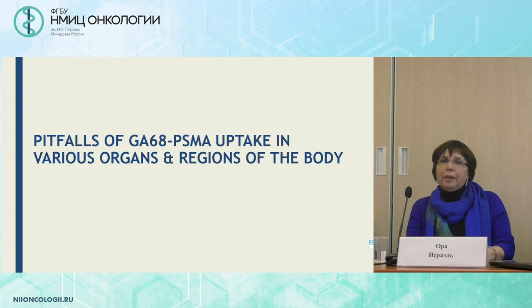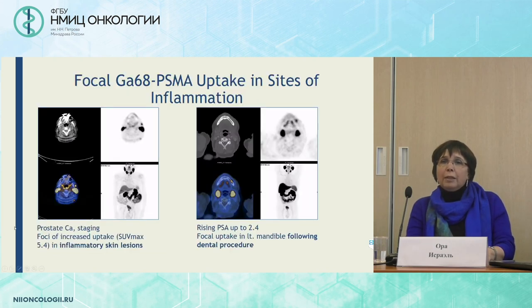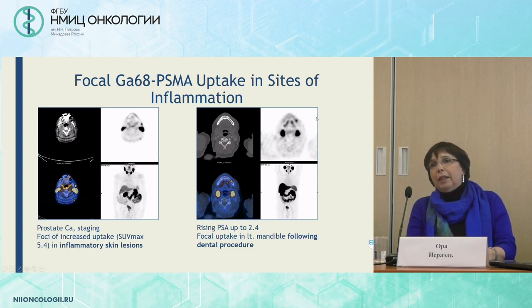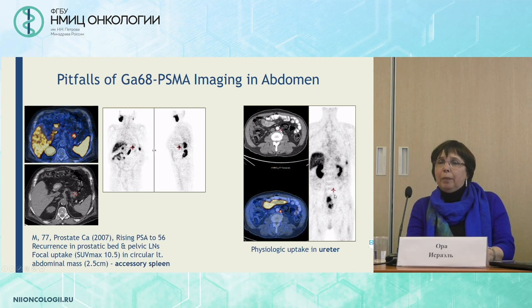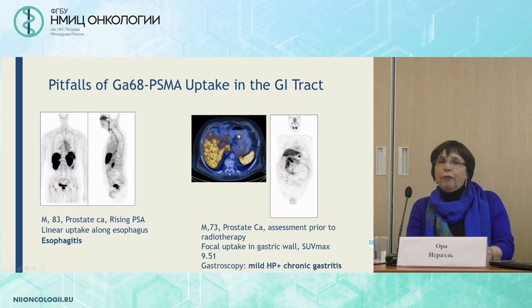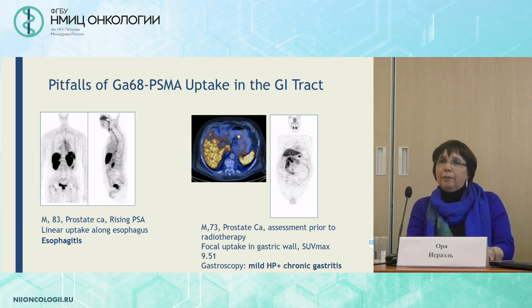A few more pitfall samples in various organs. When looking at the skull and head-and-neck area, we can see uptake in inflammatory skin lesions, uptake in an inflammatory process following a dental procedure, and uptake in accessory spleen. There is also a case with uptake in a peristaltic region in the ureter, uptake along the esophagus as in esophagitis, and focal uptake in chronic gastritis — very dangerous to report.